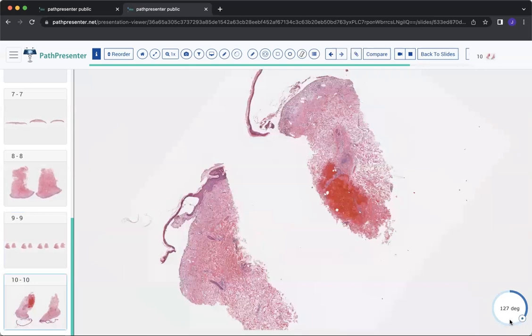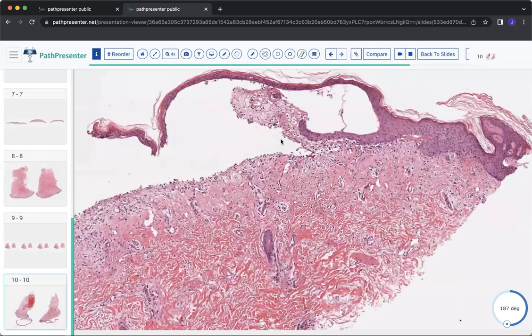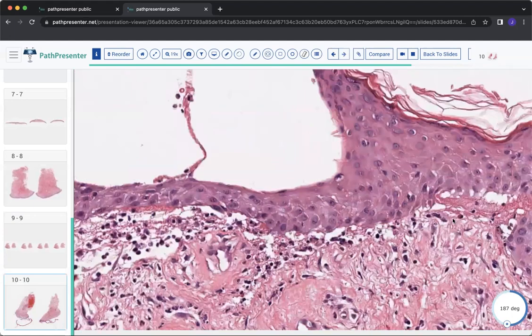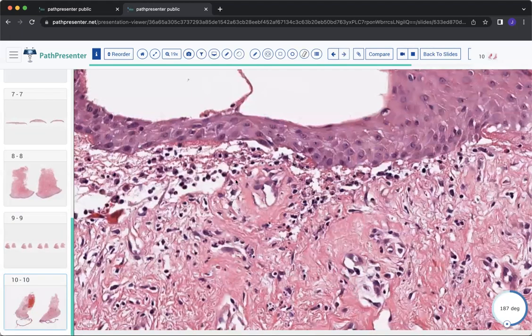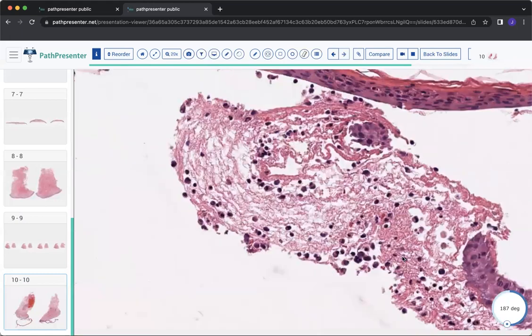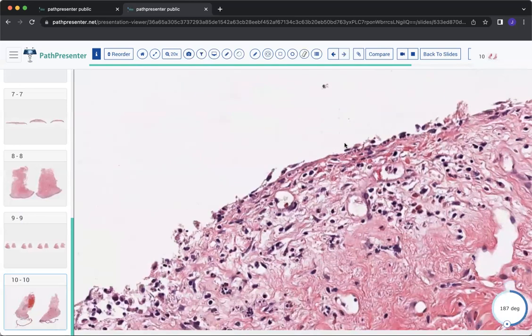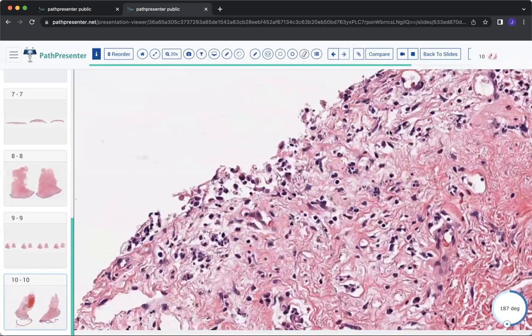And the last example is another subepidermal blister, subepidermal bulla here, and it's got areas of significant neutrophilic inflammation. So the other differential diagnosis for neutrophilic inflammation without a lot of eosinophils, forming a subepidermal bulla, you should be thinking about bullous lupus. Bullous lupus, interestingly, also has autoimmune activity against collagen 7.